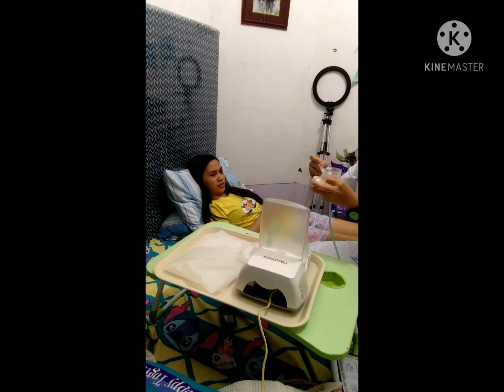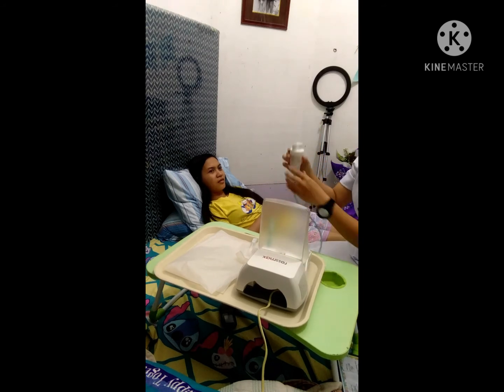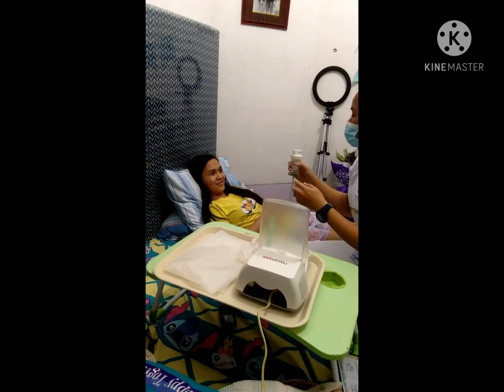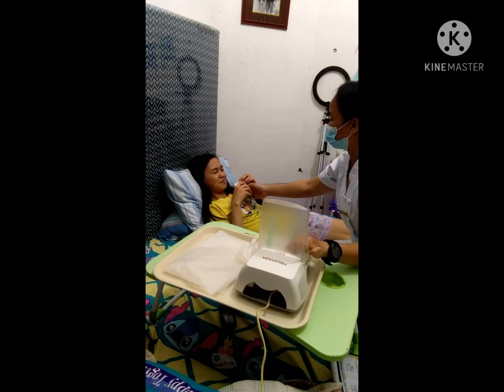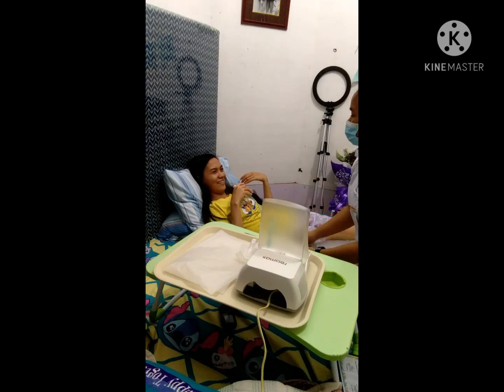Fill the nebulizer cup with the ordered amount of medication to ensure that the required medication amount is given. Turn on the air compressor to ensure the efficient evaporation of the medication. To check that the equipment is working, spray should be observed from the nebulizer. Encourage the patient to breathe the nebulized vapor through the mouthpiece to help the medication travel to the lungs for maximum effect.